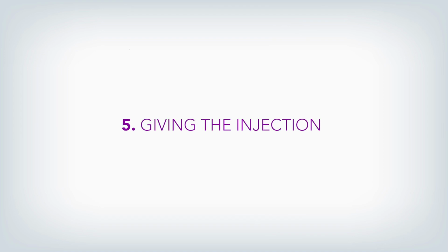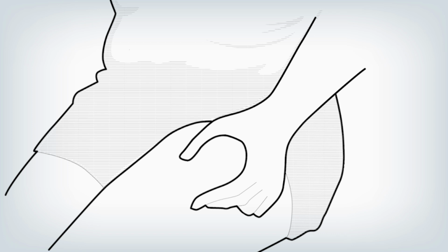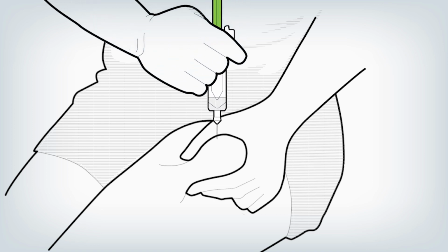When you are ready to give the injection, pick up the syringe by the middle part and hold it comfortably in one hand. Do not pull or press the plunger. Use your other hand to gently pinch a fold of loose skin around the disinfected area between thumb and index finger without squeezing. Pinching the skin is important to ensure the medication is delivered under the skin into fatty tissue but not muscle. Otherwise, the injection could be uncomfortable.